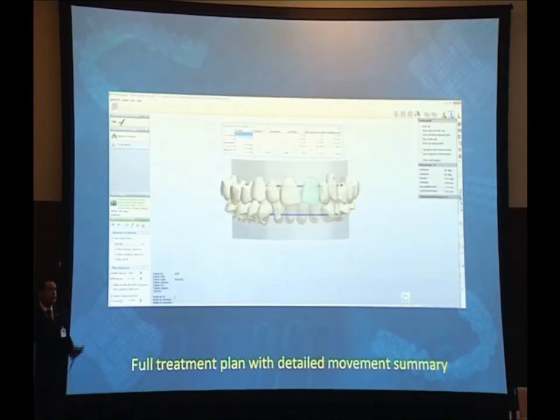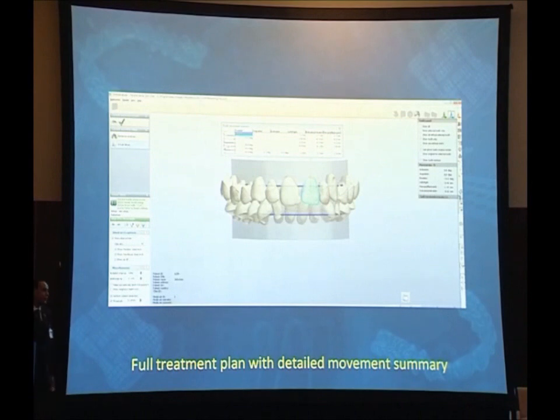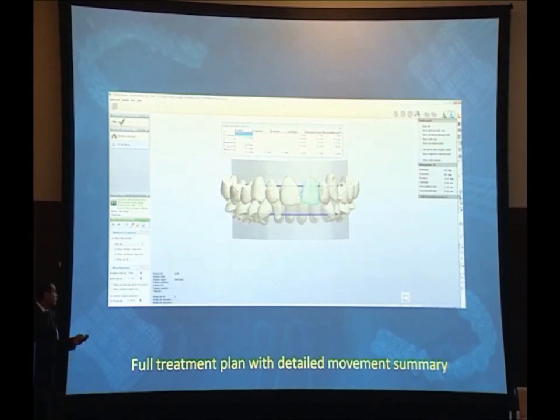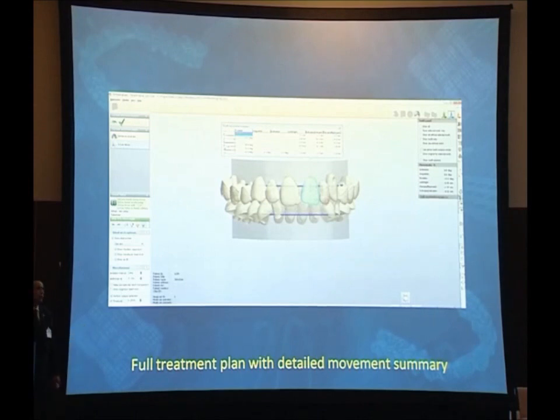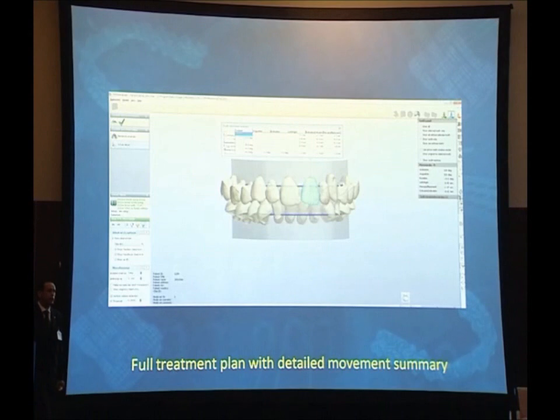And here we can find the outcome of the virtual setup, and we can see that there is a lot of information that we can gather about the accurate measurements for each tooth movement.